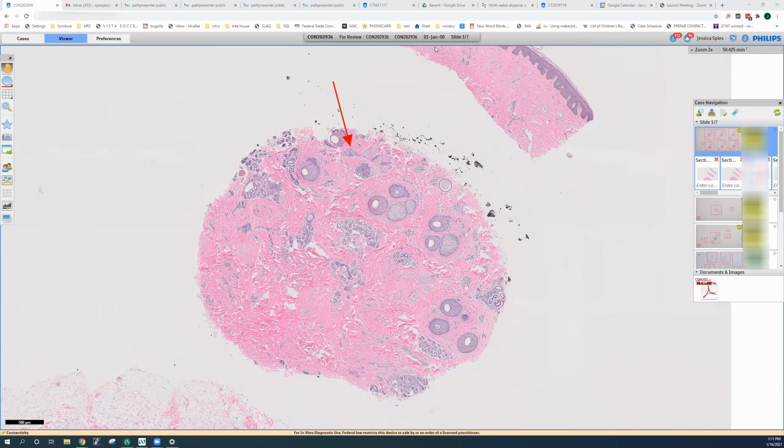This chapter mainly concentrates on syphilis and Borrelia infection, including venereal syphilis, non-venereal syphilis, which is Pinta, Yaws and Bejel, and on Lyme disease. Today, I'm going to concentrate on histologic examples of the cutaneous manifestations of venereal syphilis, caused by Treponema pallidum, and Lyme disease, caused by Borrelia species. Since this is such a short chapter, I'm also going to throw in a quick run through of some fun cases from my practice this week.